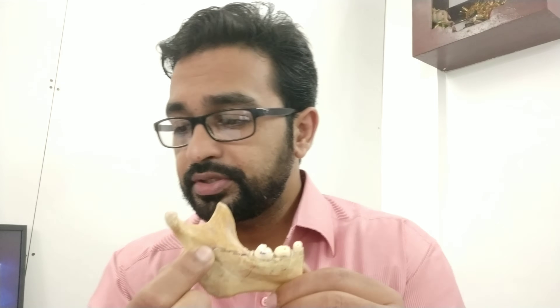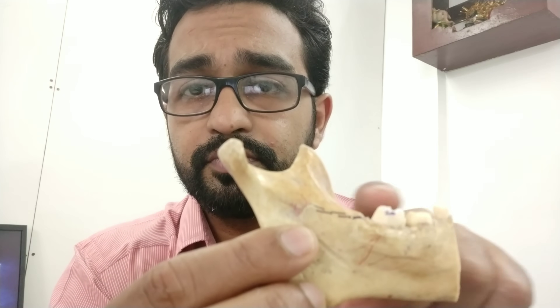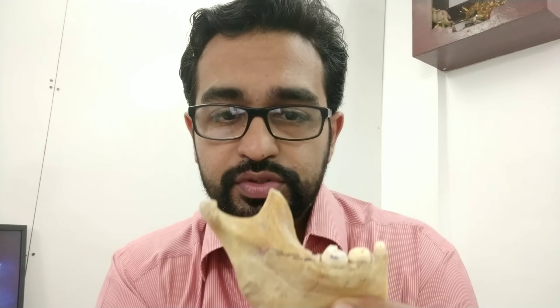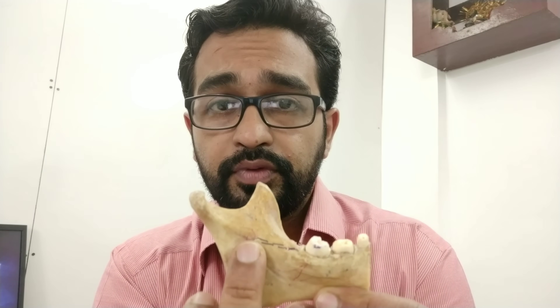The key landmarks to keep in mind are: the coronoid notch, the pterygomandibular raphe, and the occlusal plane of the mandibular posterior teeth. I have drawn a small line here — this is the occlusal plane of the mandibular molar and it coincides with the lingual side. This is the point you palpate, and from there you go posteriorly to the pterygomandibular raphe. Three-fourths from it, you give the injection.